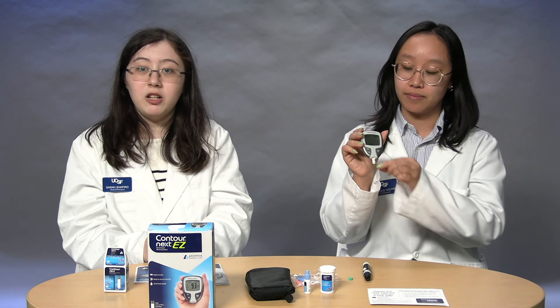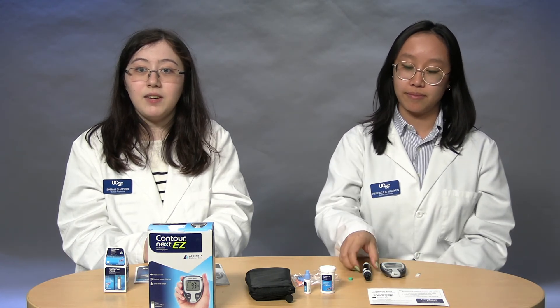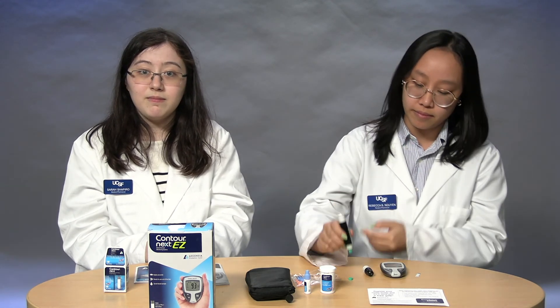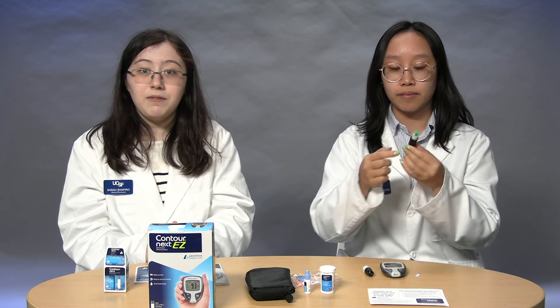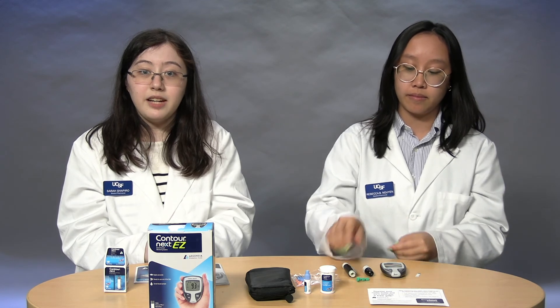For the disposal of used supplies, pull the used test strip out of the monitor and toss it in the trash. Uncap the lancing device and, with the circular cap you kept from earlier, cover the needle. Push the lancet ejector on the side to dispose of it directly into a sharps container. You can get a sharps container from your pharmacy and can return it when full. Reusing your lancet can make the needle blunt and cause more pain, and it can also increase your risk of getting an infection.